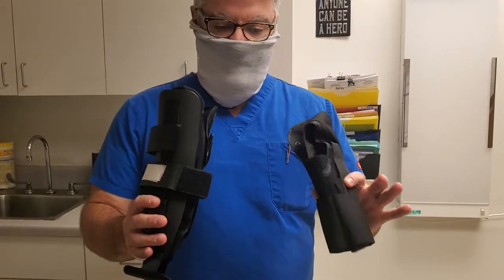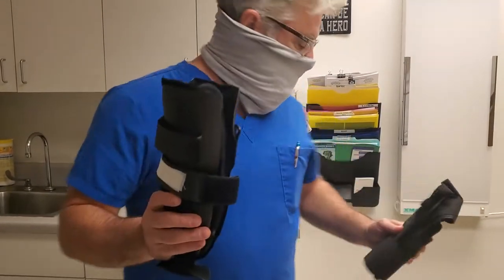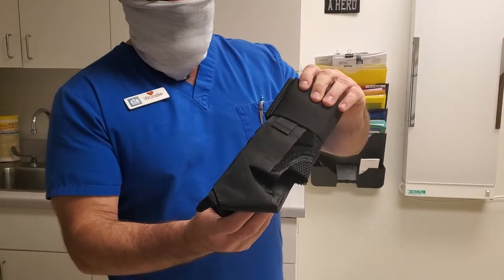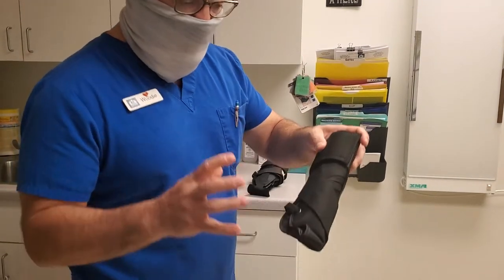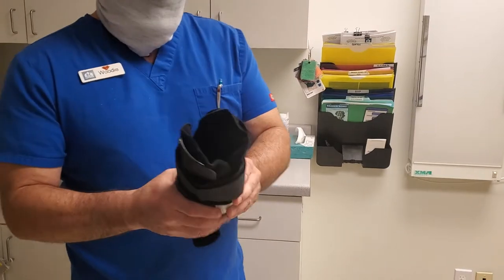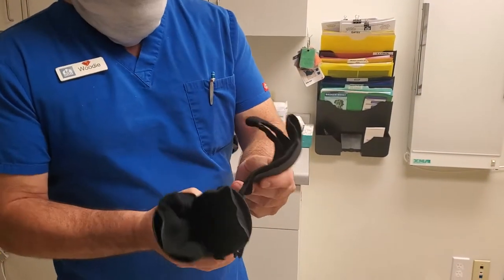We have two that we're going to demo today. We have your standard stirrup ankle brace and we also have a lace-up ankle brace, which I'm going to undo during the video to show you how it actually opens up all the way. The first one we're going to talk about is this stirrup brace, which comes in two forms.